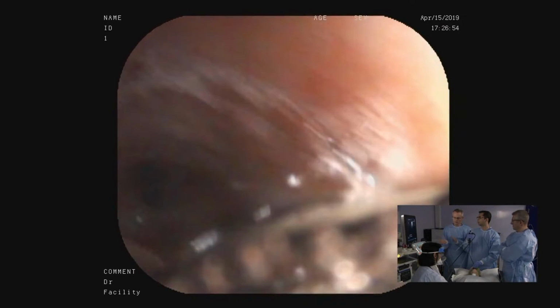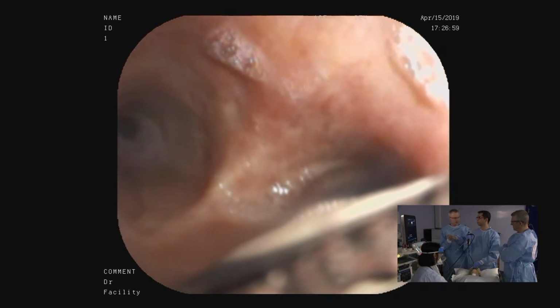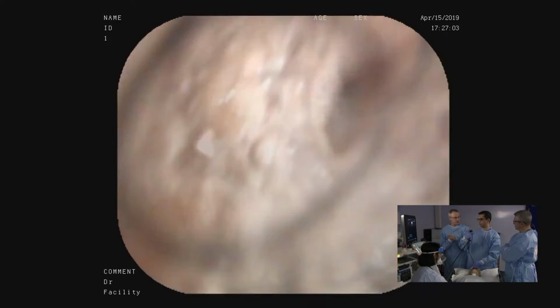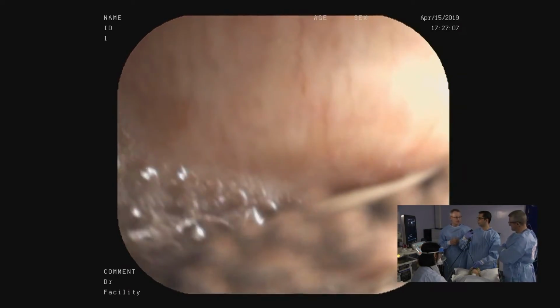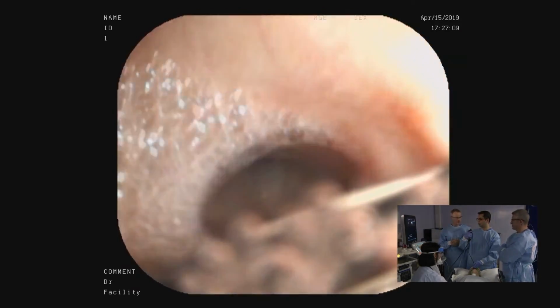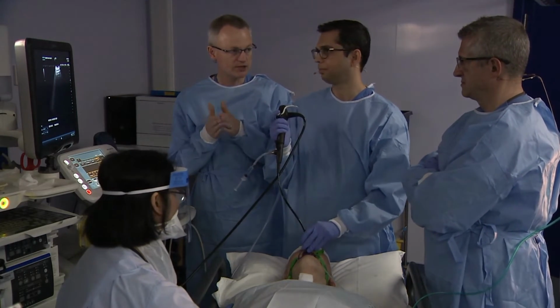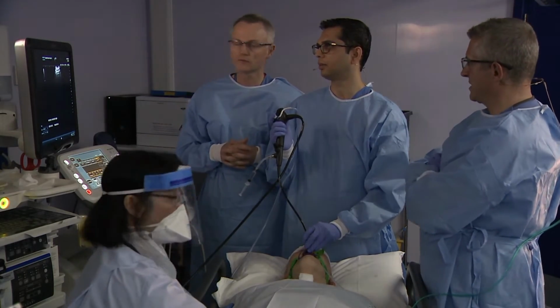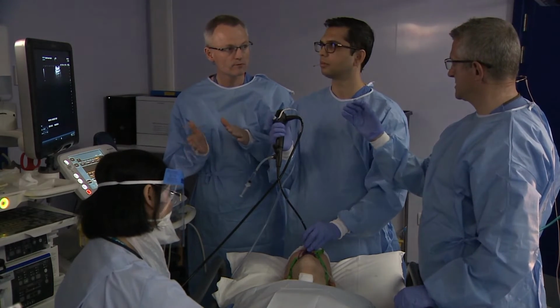When you do that maneuver, when you go anti-clockwise, for the beginner, do you tip up? Do you angle up? No, you just rotate the hand. Just rotate the hands, absolutely. And then you do the tip up, thumb down, so there is a good contact, so that you get apposition of the probe onto the mucosa. So whenever we say rotate anti-clockwise or clockwise, what we're talking about is a subtle movement of the wrist. That's all.